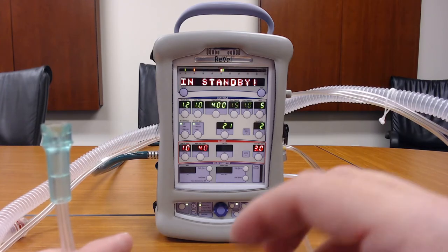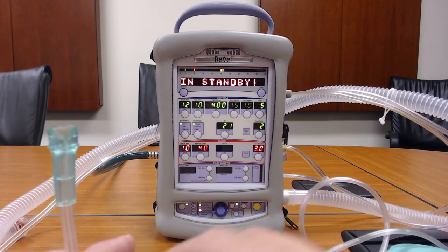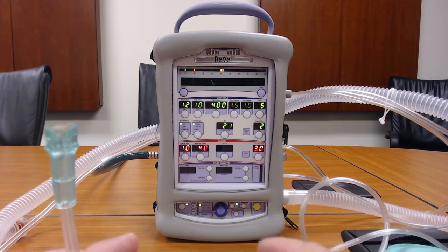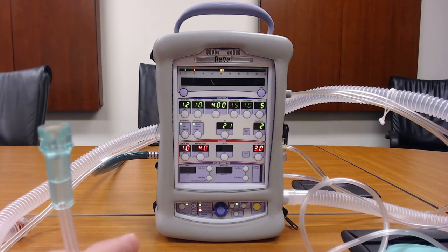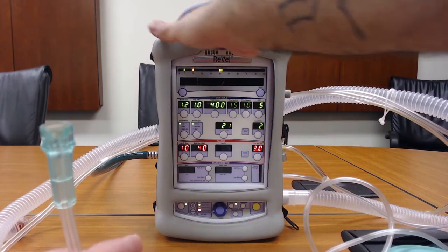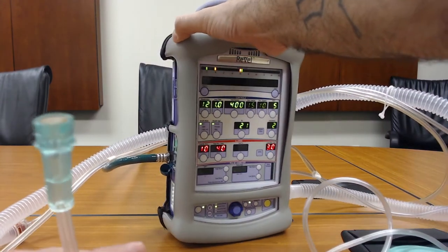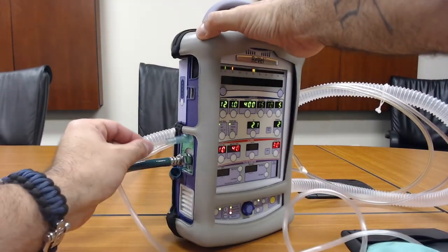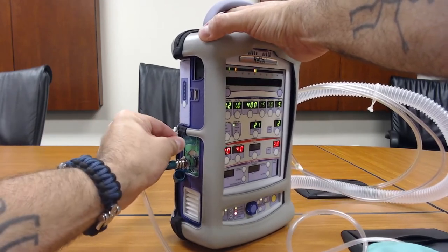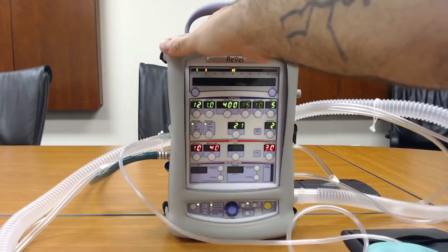With a separate oxygen source, it'll run even on the exhalation side of the vent cycle — the medication will be flowing into the tubing. You would also have to manually shut off the oxygen source once the treatment was completed. However, if you choose to use the ventilator, you're going to attach the O2 tubing to the port just above the high pressure port, specifically for nebulized medications.